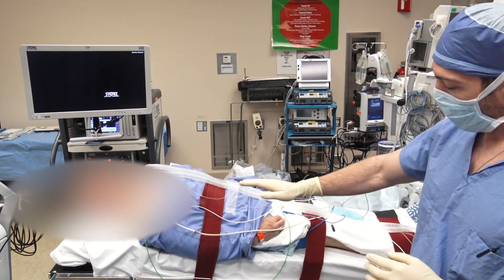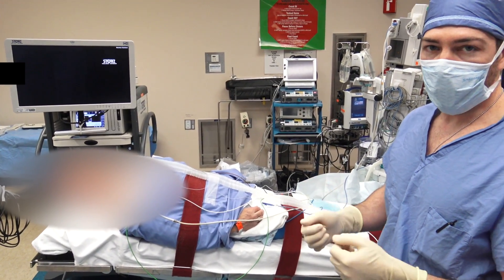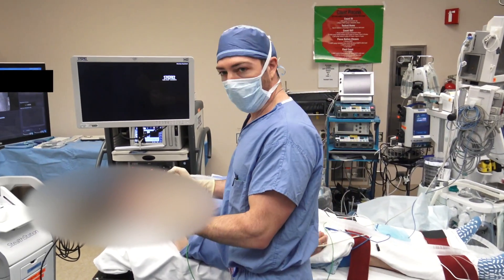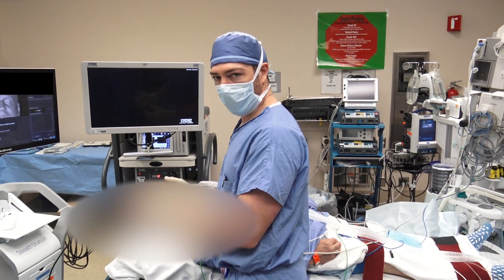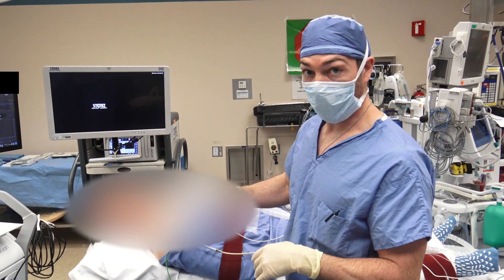Typically, the patient's placed at an incline — lower reverse Trendelenburg. I'd like it to be at least 15 degrees. It can be changed a bit based on your height. We typically do it so that our elbows are roughly at 90 degrees as we work. So height roughly like this is okay for someone of my height, but it can be adjusted based on your particular height.